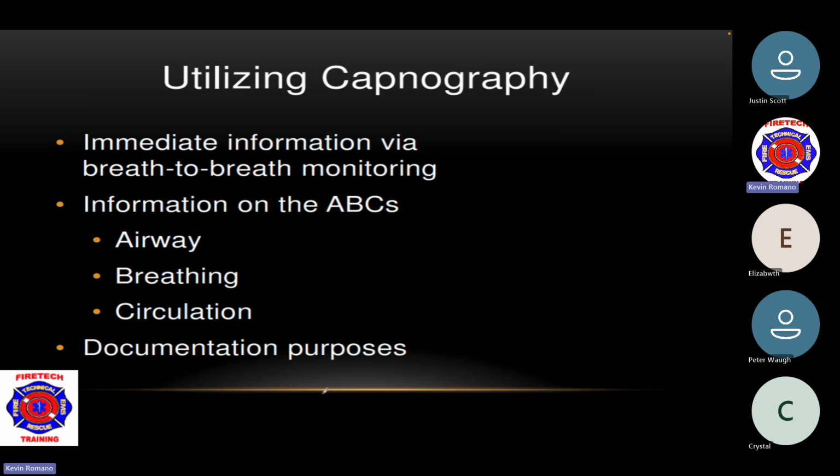So if I have a patient who is showing a bronchoconstrictive waveform and I start giving bronchodilators like albuterol or DuoNebs, things like that, I hope to see the bronchoconstriction go away. We have bronchodilation, and I start seeing more of a normal waveform. So I can actually trend my treatments and see what's going on with these patients as I'm making them hopefully better. Or is it getting worse, and do I need to go down a different path?